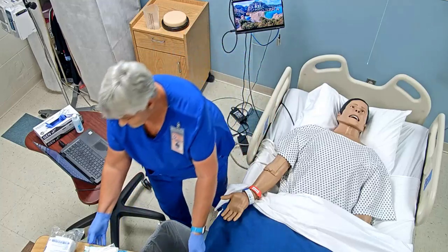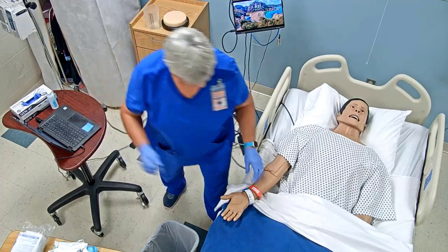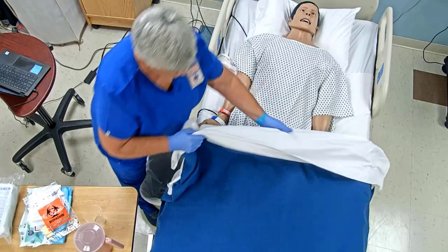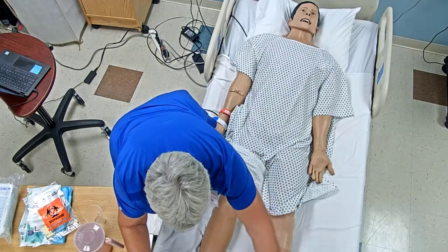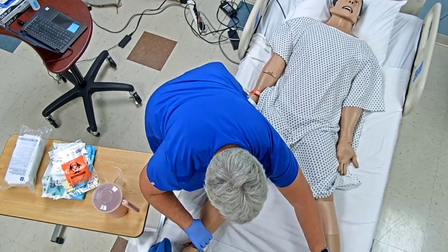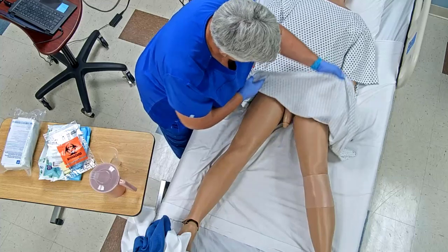Okay, all right, let me move this out of the way just a little bit. Got our privacy. Let me move my trash bag up here. I'm going to need you to spread your legs as far as you can, and we're going to go ahead and expose you.